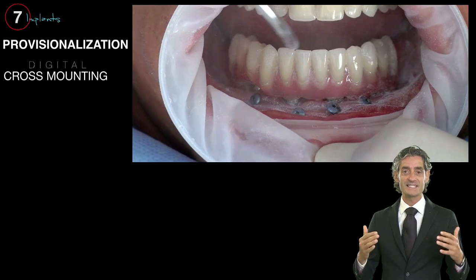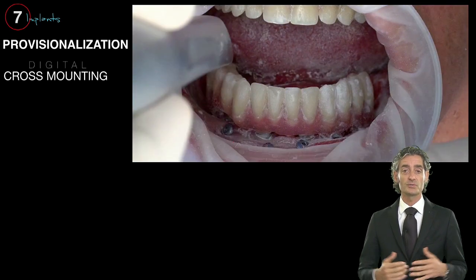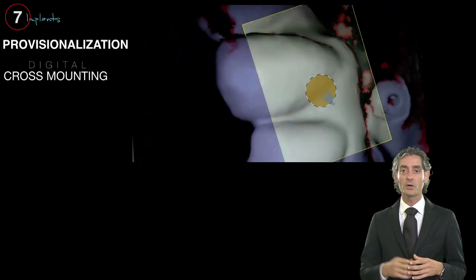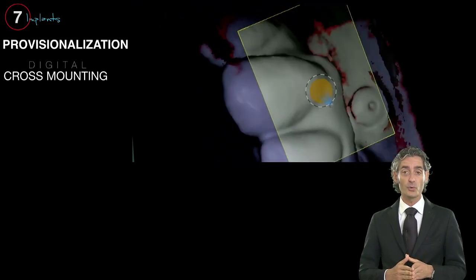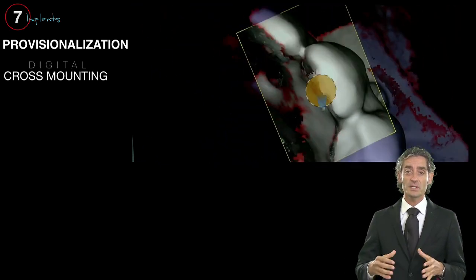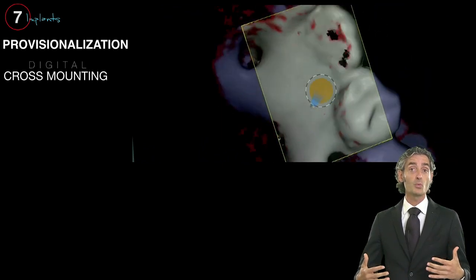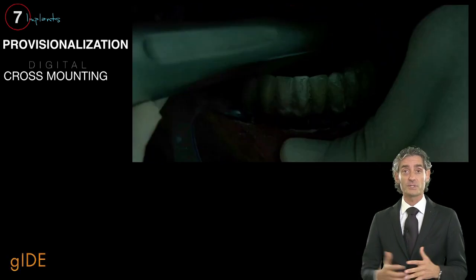We are going to do exactly the same. We powder the lower arch, and through the use of the intraoral scanner we take the impression, always looking at this reference, this screw that we put in the frenulum. Then we take this precise impression of the provisional restoration that was working so well in the mouth, and then we have to copy it in the final restoration.